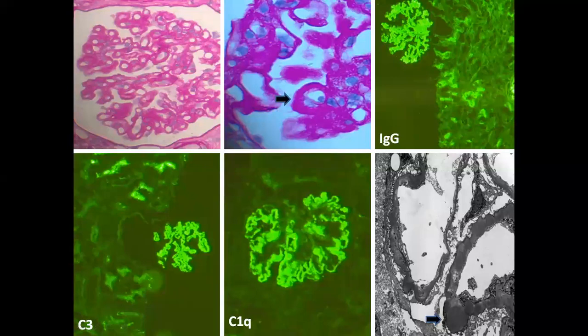The other thing in ultrastructural examination is you look for mesangial deposits, you look for subendothelial deposits, and you also look for tubuloreticular inclusions in the endothelial cells. These are the three things which we need to be careful about. Tubuloreticular inclusions per se, if they are there, it is not necessarily lupus. They are commonly seen in lupus nephritis, but they can also be seen in viral infections, HIV positive patients, and patients on certain types of interferon therapies. So it can be seen in viral infections, autoimmune diseases, and patients on interferon therapies. It is not very specific for lupus.